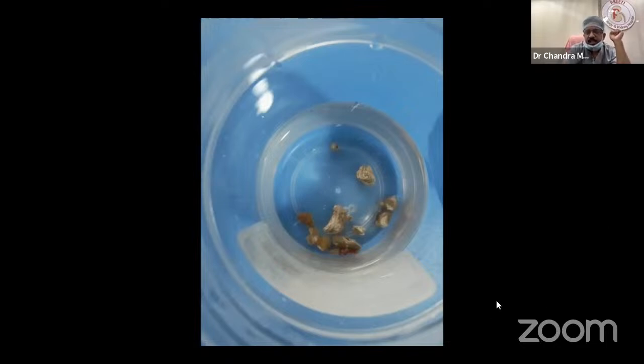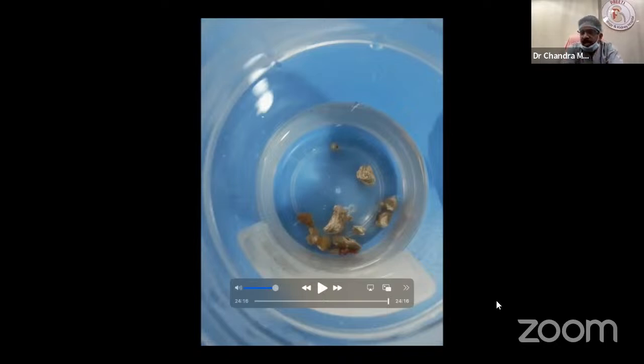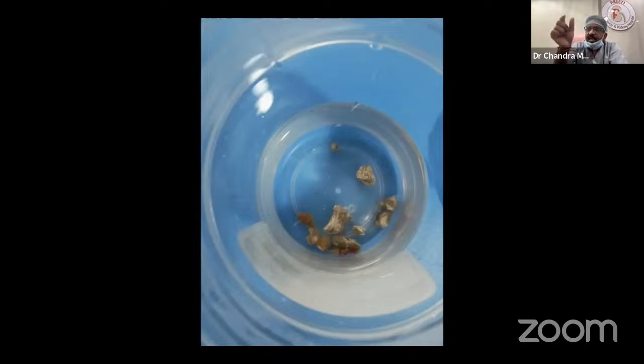So with this, our presentation, the external video of nephrostomy fixation is nothing great. Inject contrast. One advantage of the nephrostogram is that dye trickles by the side of the nephrostomy and it will show whether the colon or pleura is injured. That is very valuable information. I have done it in this case, but it's not incorporated. The video ended here.